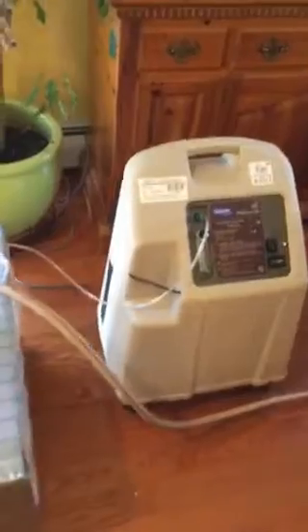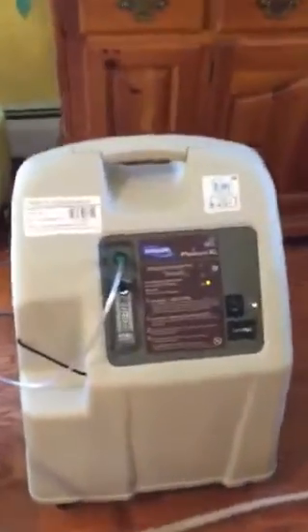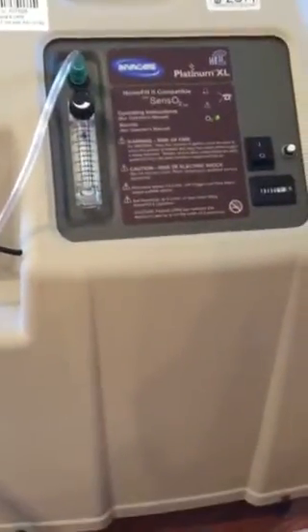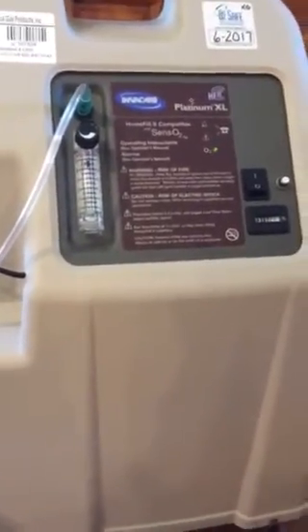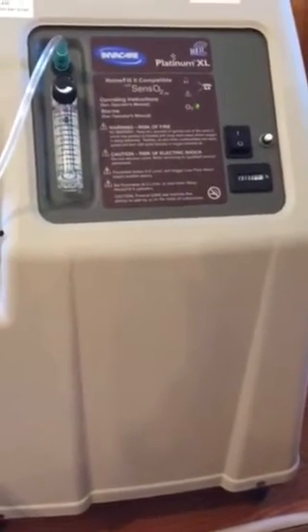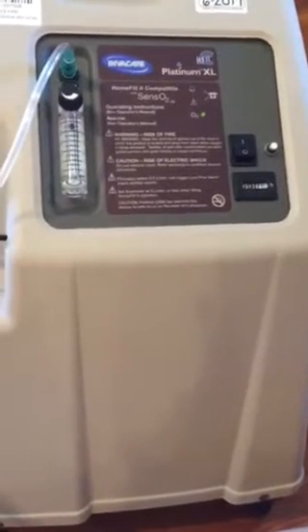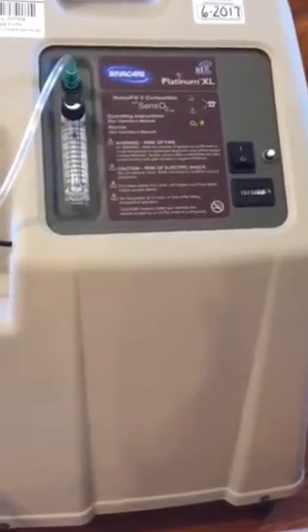Now on the right you'll see that here's my concentrator. It's a very nice unit. You just turn it on off switch and set your flow rate here on the left hand side, which right now I have at 5 liters per minute, and it keeps up very nicely. If my dog needs, he goes inside, I turn it on, and he has relief right away.